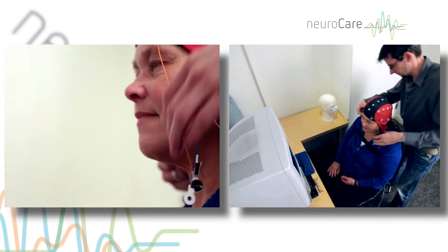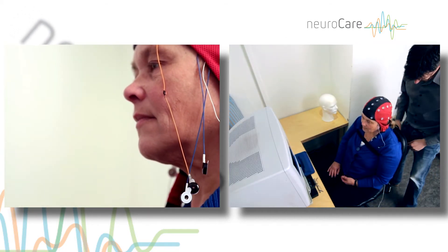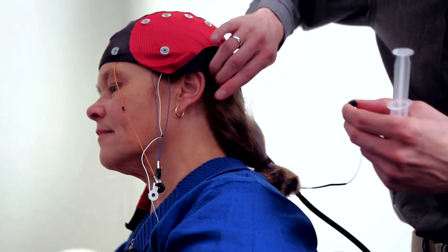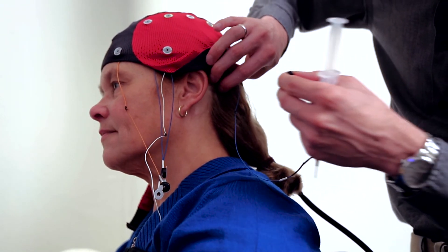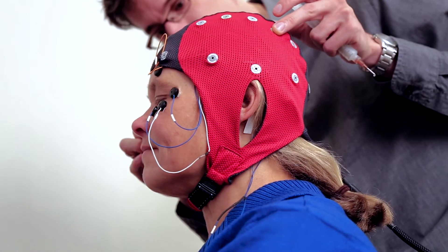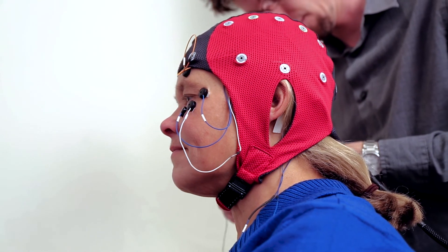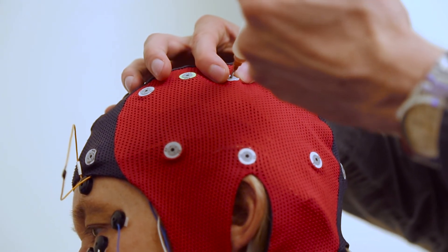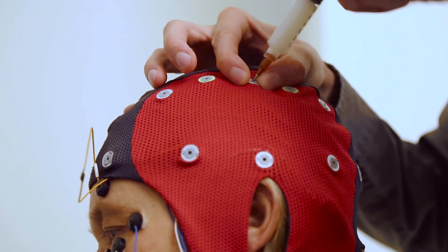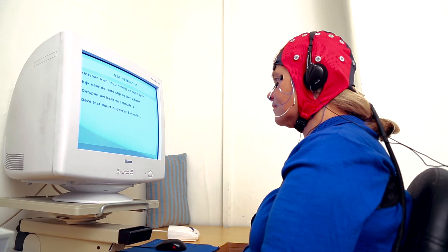The clinician places a specially selected cap on the client's head. This cap contains electrodes that measure the electrical brain activity. The cap also contains a number of electrodes that are attached to several places on the face, such as around the eyes and the jaw. Among other things, these electrodes measure eye movements and muscle tension. When everything is properly connected, the QEEG assessment begins.